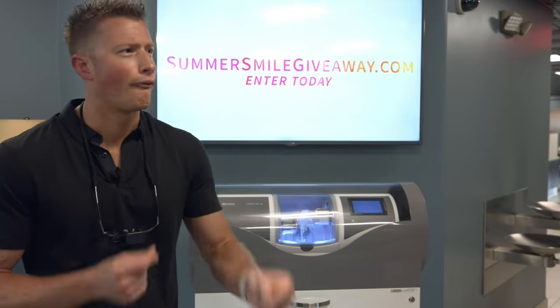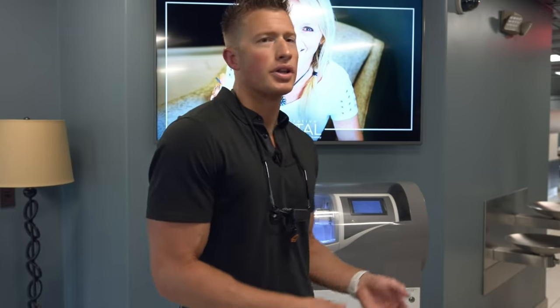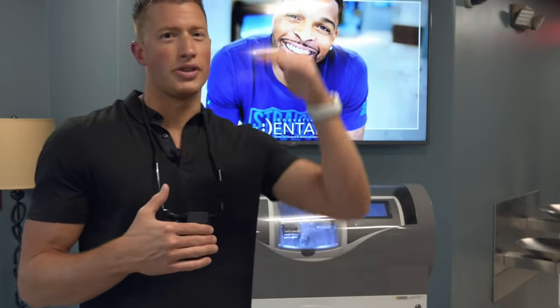What questions? Come on, do we have any others? What if they had a tooth removed years ago and the other teeth have started moving in? It just depends on how badly they shifted. Like for Trey, he's got some shifting there. It's just not too bad, probably about half a millimeter to a millimeter. It's not significant enough that we can't still place a beautiful implant that's very upright and doesn't leave these big traps. A lot of times the shifting is so much that the tooth needs to really be uprighted, and that's where Invisalign or braces would come into play and give us a big benefit to upright that tooth. And just like the x-ray I showed you earlier, a lot of times we'll run into a case where the tooth above has come down.